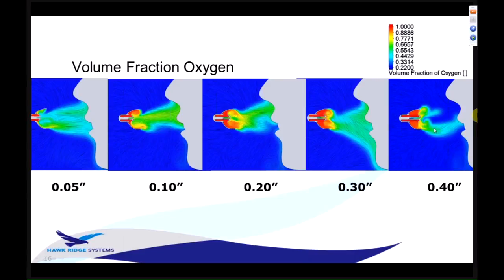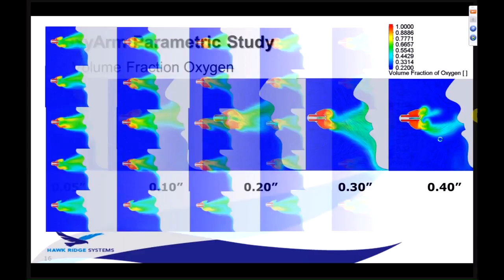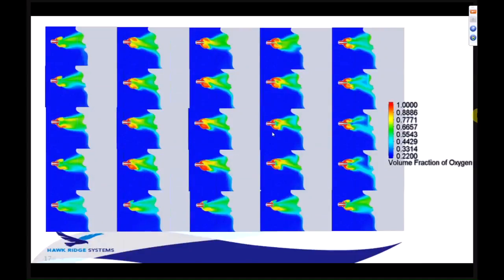You can also go to a 2-factor design study, where we're changing both the offset on the horizontal axis and the angle on the vertical. In this case, it's 25 analyses run with a single click. So there's a little bit of solve time involved there, but again, we can go interrogate these outputs and grab the one that looks like most optimized for our situation. And this really is activated by this connection we have between CAD and CFD.